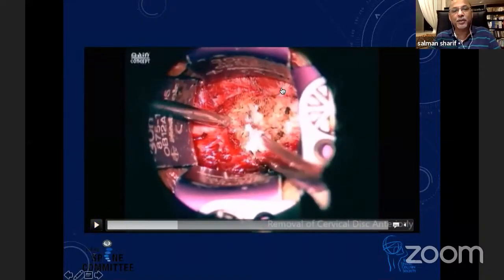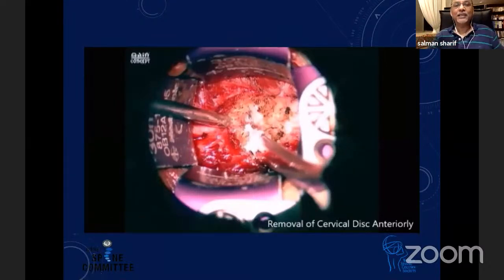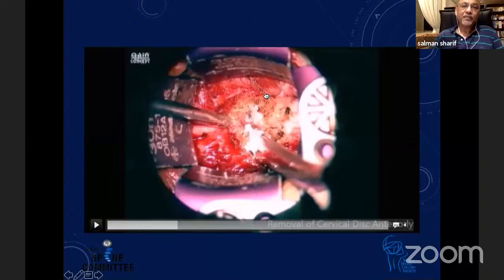Sorry, I'm going to stop here because unfortunately, the majority of the time we bring the microscope in once we are on the disc. Same was the case here. And you can see these are the two lateral sides. This is superior and inferior. And what we have is longus colli on both sides dissected, and underneath, the prongs are underneath, so it's static.